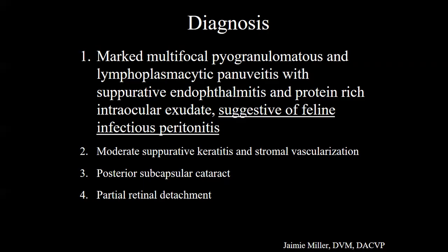I think there's something about the tissue tropism. Yeah, and what that implies is that for pathologists out there, if you're going to suggest IHC in some of these cases, the more exudative ones with free-floating macrophages are the ones that are more likely to be positive. Sometimes we get a few of those where they have a suspicion of FIP, but inflammation is mainly uveal and lymphoplasmacytic. Just be aware that that might not be a good candidate for IHC.